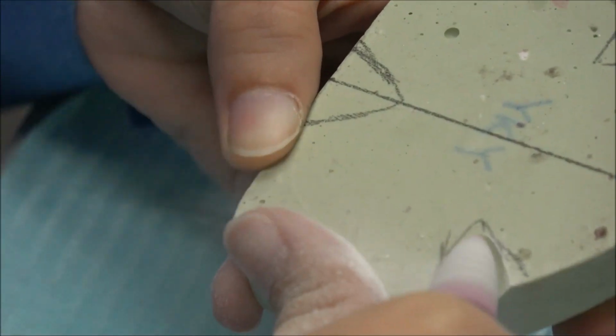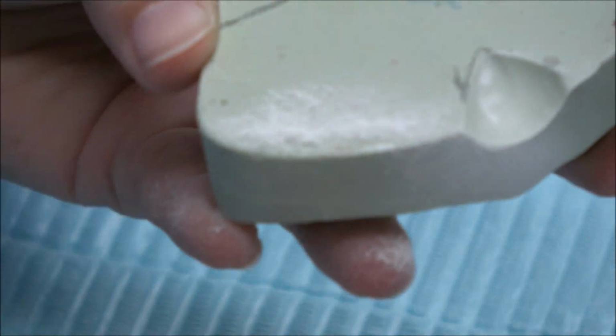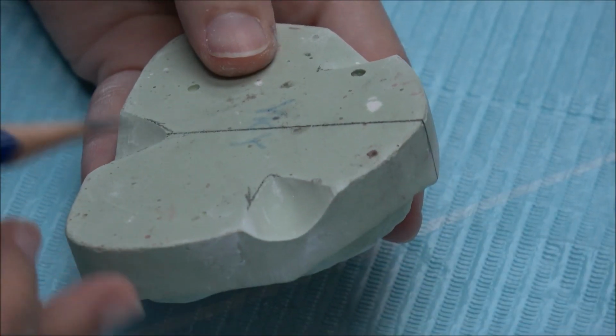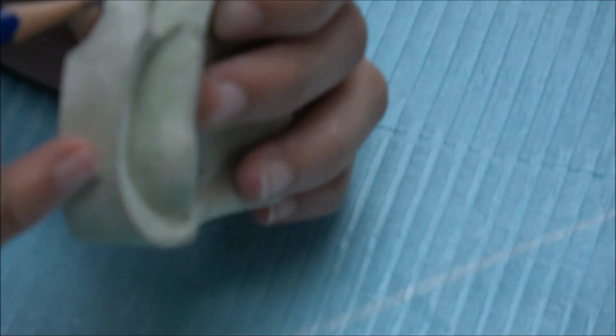Follow the line we draw, and then make sure there is no undercut. Something like this. Okay? And make sure there is 6 mm depth. And then make sure here.